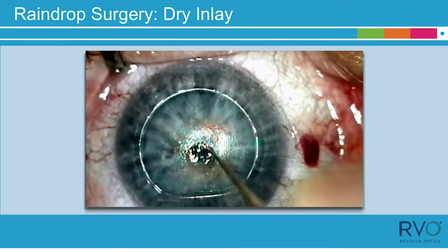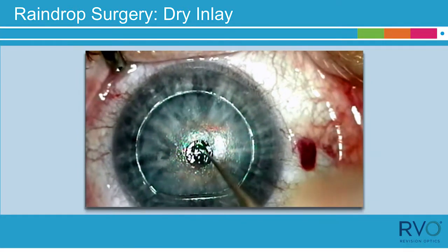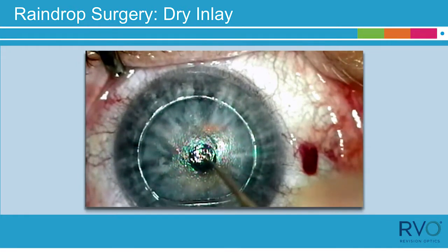Use the elbow of the Sinski hook to move by pulling, not pushing, the inlay to the center of the light-constricted pupil.